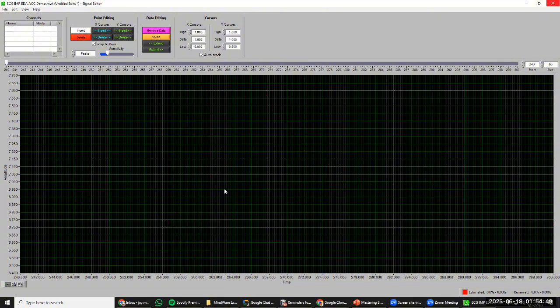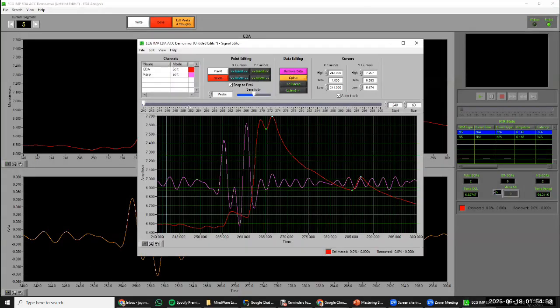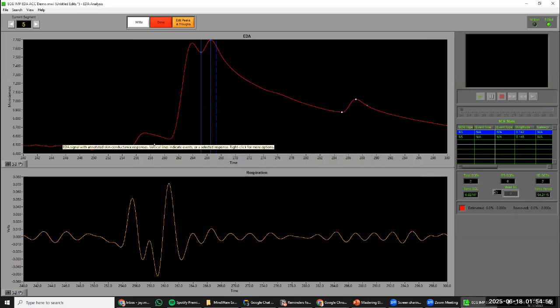Okay, and just to go over a couple different ideas here. You can see that we have a very large SCR due to this respiration here, and it does take quite some time to return down to, if we imagine this is a normative baseline for them, around 6.5. So by having this very large respiration, it is increasing the total mean skin conductance level.